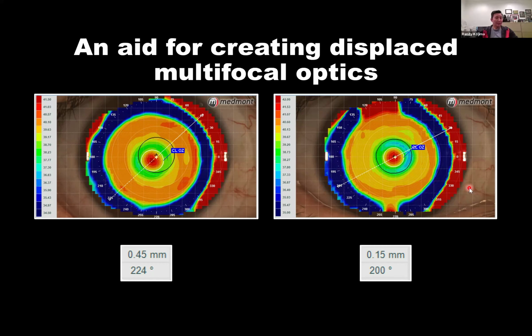The smart lens scleral design will allow us to decenter the optics wherever we need them to go. So that's one option. And the smart lens can be made with a distance center or a near center multifocal, either one.